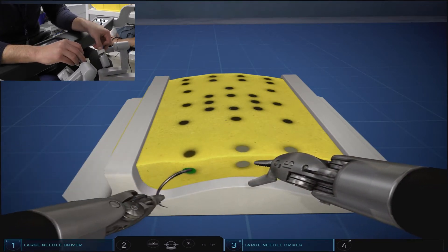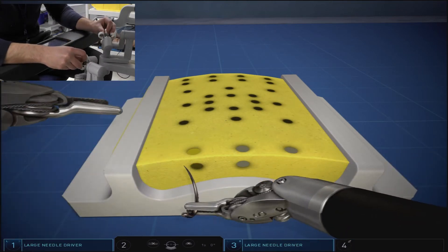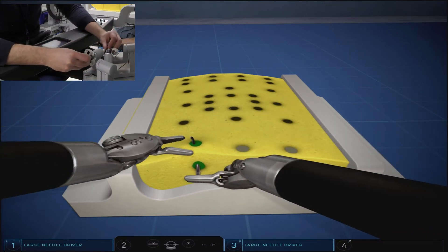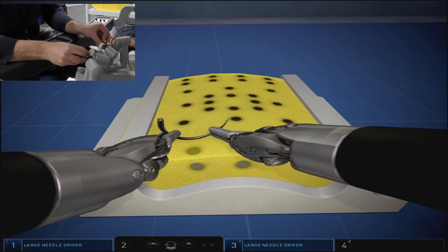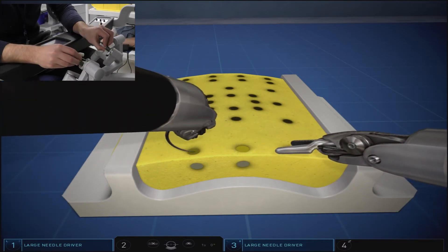Of all the VR simulated suture exercises, we found this one to be the most clunky and sometimes glitchy. We've had multiple runs where the needle seems to get stuck, either on entry or on pull-through. And even releasing the needle after a successful throw, the arms seem to jump forward occasionally.